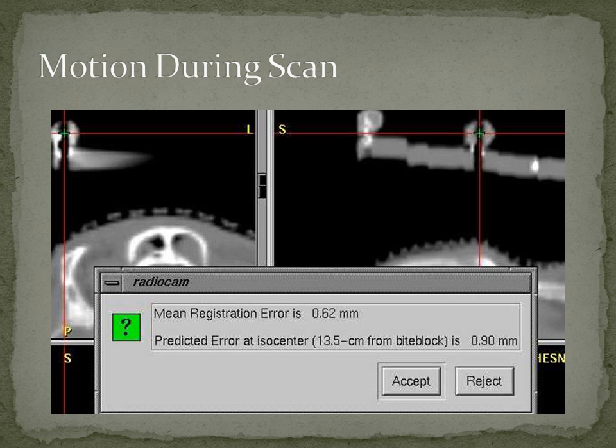And then if the system actually moves, this is a patient that actually swallowed during the scan, we can also detect that the patient swallowed, and we can see that there's a misregistration error. And this is, as you think about it, something that's actually missing when we do Stealth. And very often, when we do image guidance in the OR, things tend to be off a little bit. And the reason why they're probably off is we don't have the ability to do all of these checks.